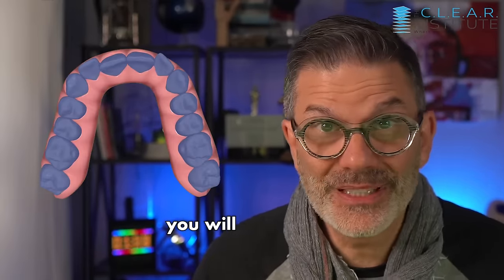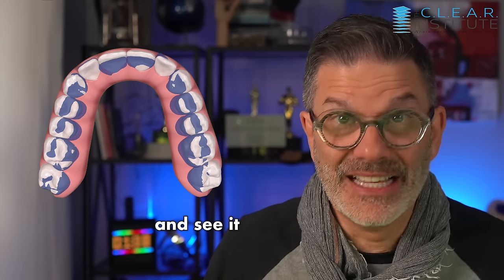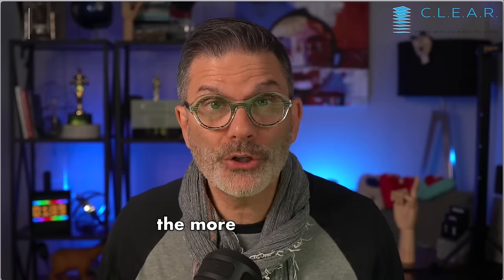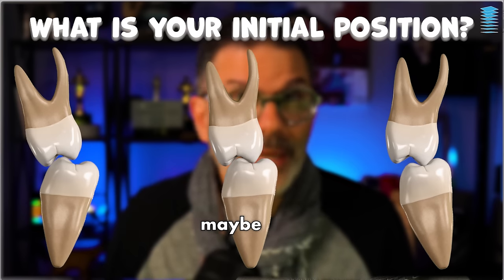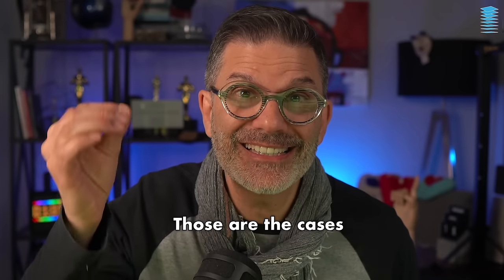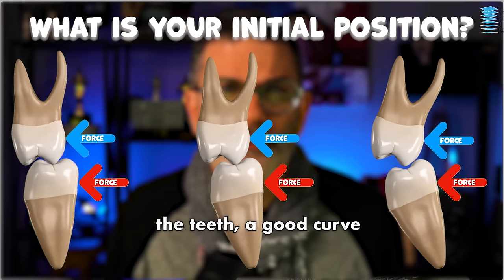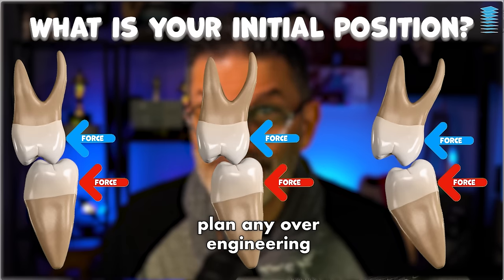But in the ClinCheck, you will not see that. So this is where you have to be a dentist and see it in your head. Now, the more you expand, the more you will have this secondary effect. And depending on the initial position of the teeth, maybe this is something you want and wish for — those are the cases where it went well. But if you start with a good angulation of the teeth, a good curve of Wilson, and you don't plan any over-engineering to counteract the side effect, you might be in trouble.